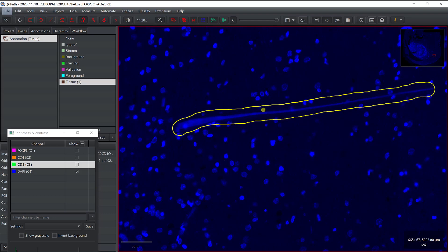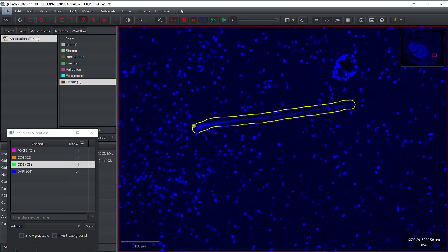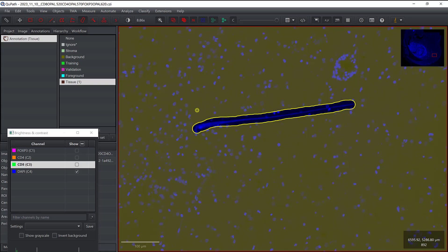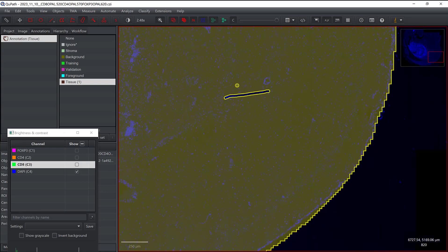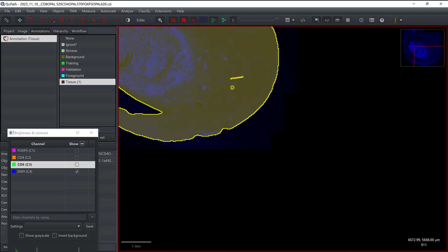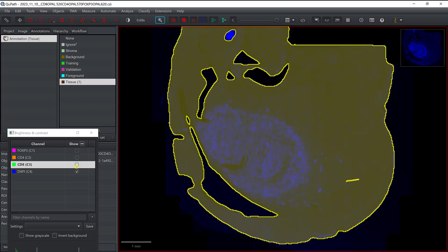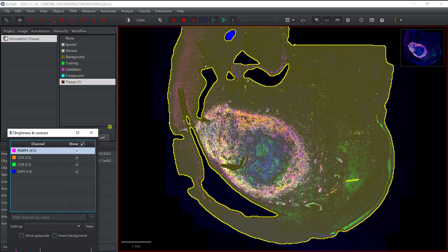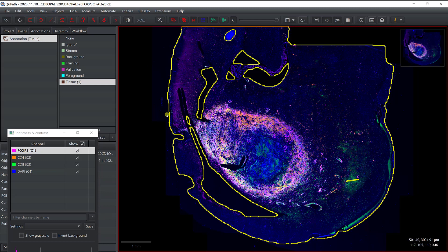If I don't remove it, I'll detect nuclei there that don't correspond to real nuclei. I can also try to be more precise on the contours — just remove the artifact region but keep the real nuclei nearby since they'll be excluded from analysis anyway. Using Shift+F again I can confirm everything looks correct, then go back to my markers. Now I'm happy with the annotation and ready to segment the nuclei.